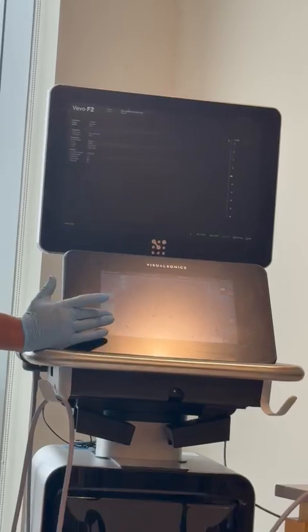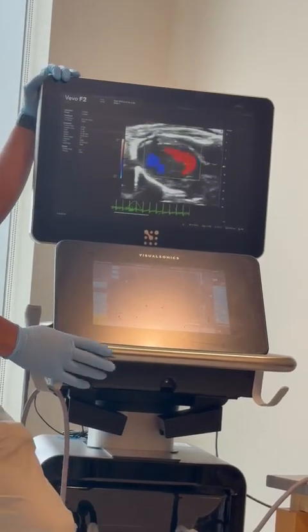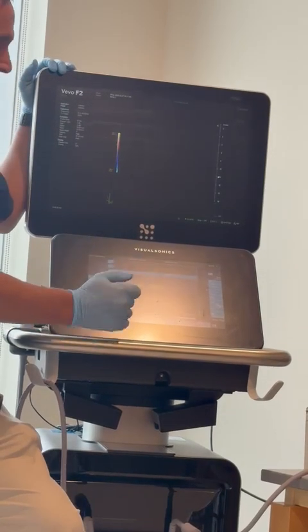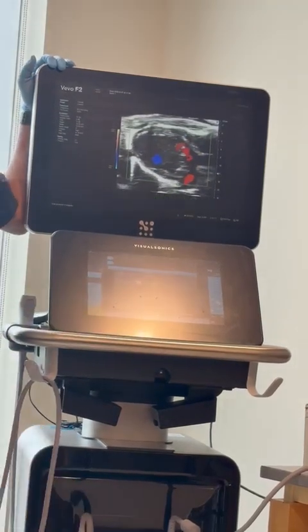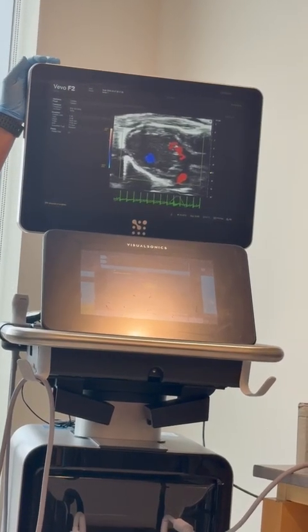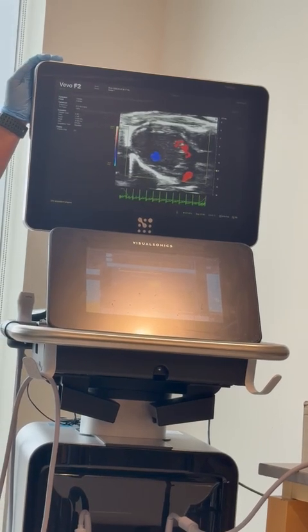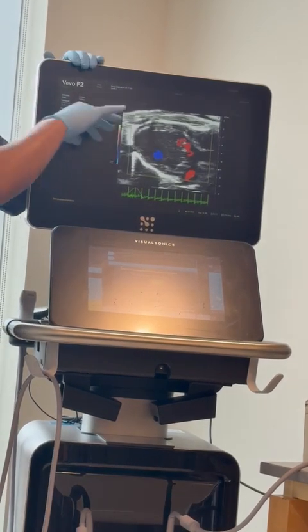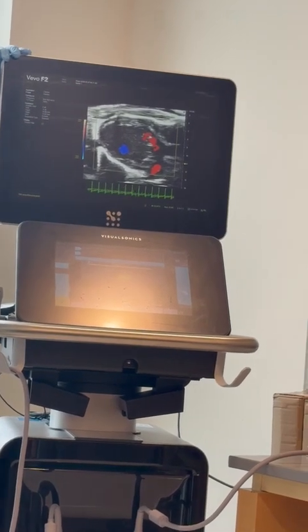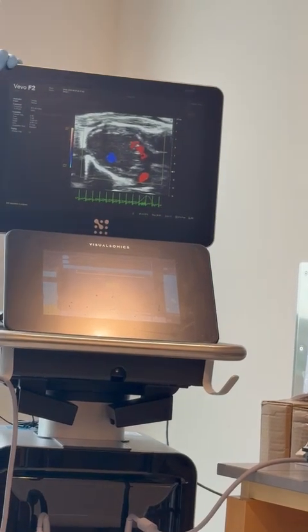And I think one that's kind of nice to do for presentations is if we did a color Doppler scan over this heart and EKV together. This will take a little bit longer, about 15 or 20 seconds, but you'll actually be able to see, I don't know if anybody does MI models in your groups, so you'll be able to actually see a thinning of that wall, and you'll be able to see pooling of blood down there. So you wouldn't actually have that nice ejection that you do in a normal heart. So another couple seconds and we'll be there.